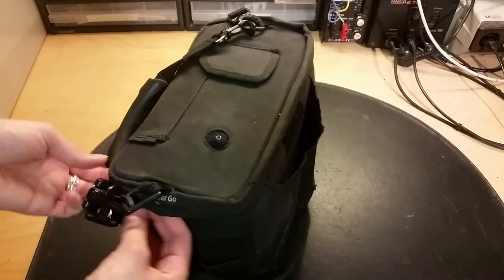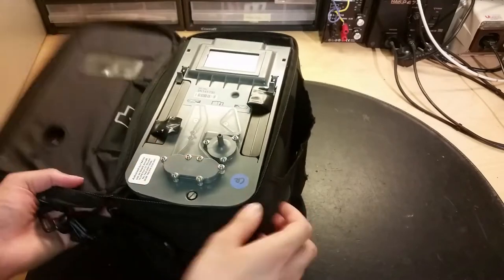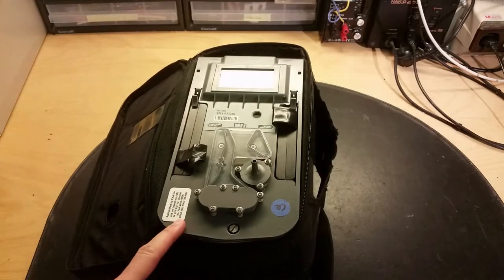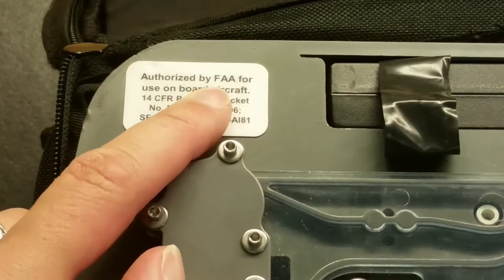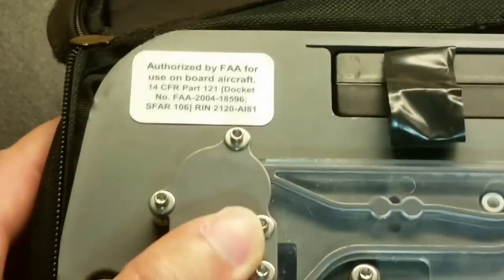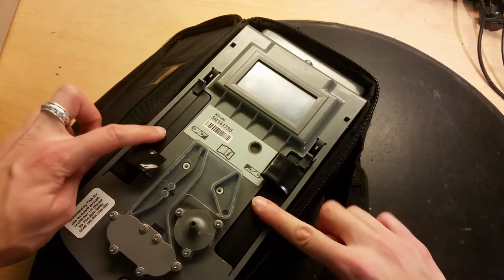It's a ziplock. Let's open it up - quite a nice unit. Here we've got the FAA approval. Authorized by FAA, which is the Federal Aviation Agency, for use on board aircraft. This was actually used in the helicopter since the hospital doesn't have any other aircraft. Here we've got a serial number and two batteries.